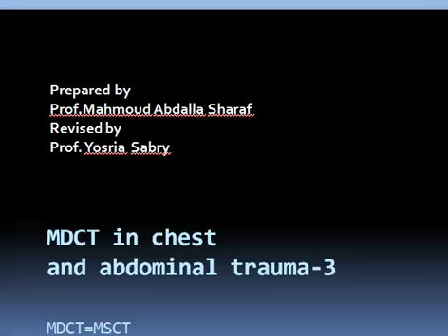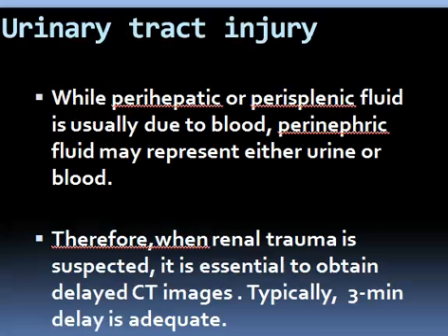This is the third presentation about the use of MDCT, or the multi-detector CT, the multi-slice CT, in chest and abdominal trauma, prepared by Prof. Sharaf and revised by Prof. Yusriya Sabri. It will be about urinary tract trauma.